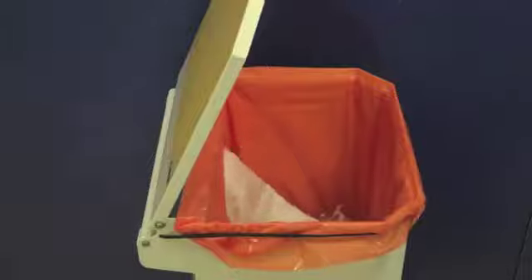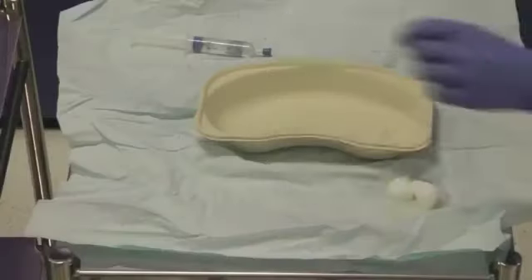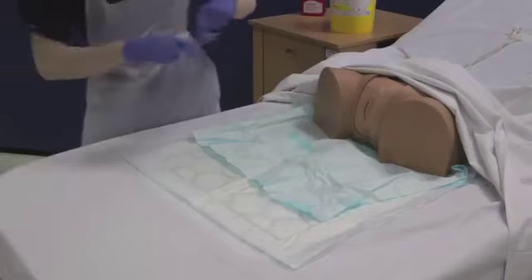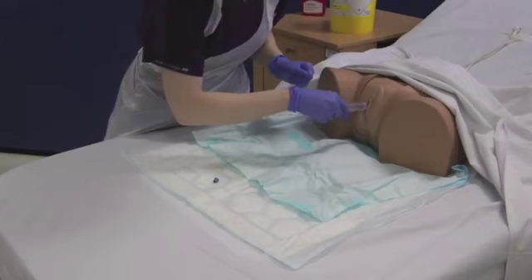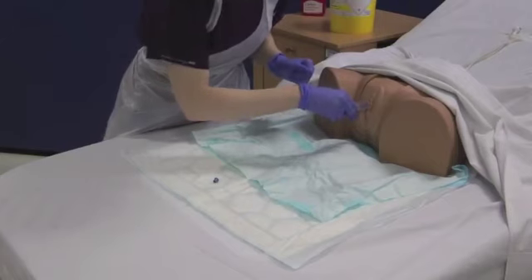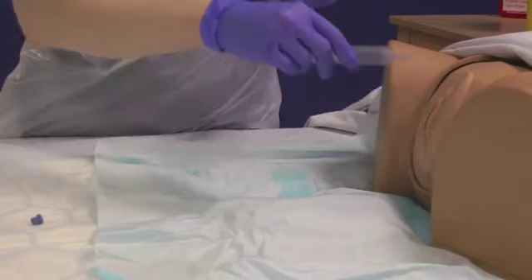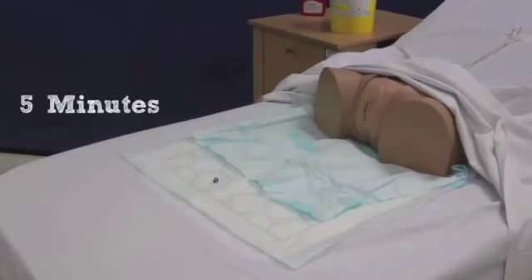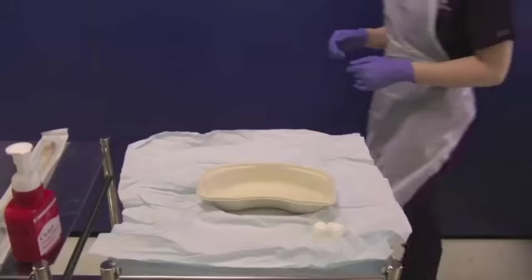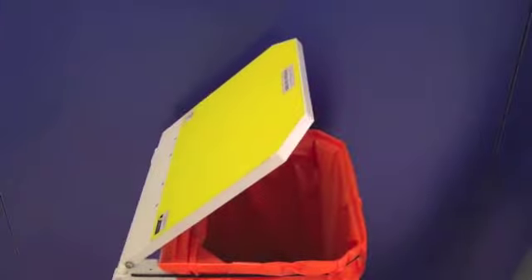Use a minimum of 5 cotton wool balls, cleaning from front to back, symmetrically from outside to in. Once you have finished cleaning the genitalia, take your instillagel and insert only 6 milliliters into the urethra. Dispose of the syringe into the sharps bin. Allow 5 minutes for the gel to take effect. Remove your gloves and decontaminate your hands.